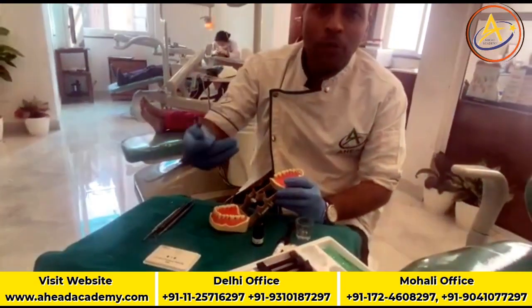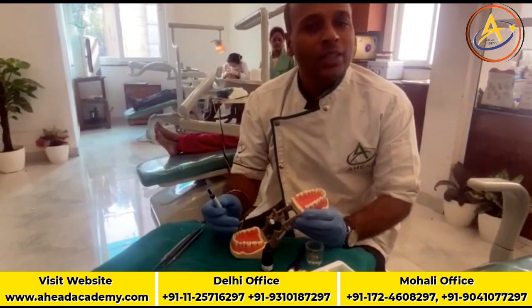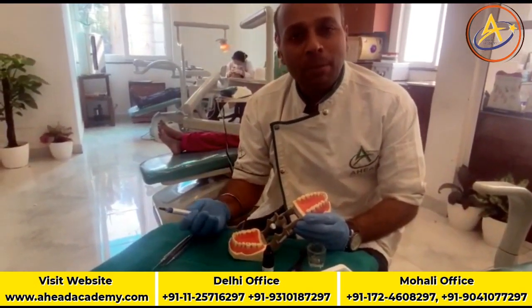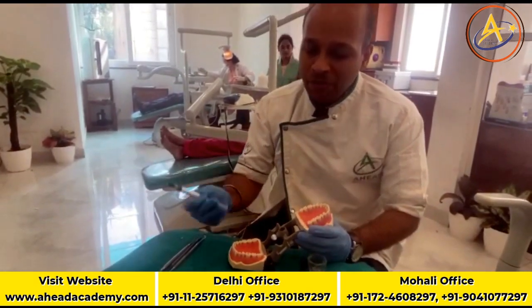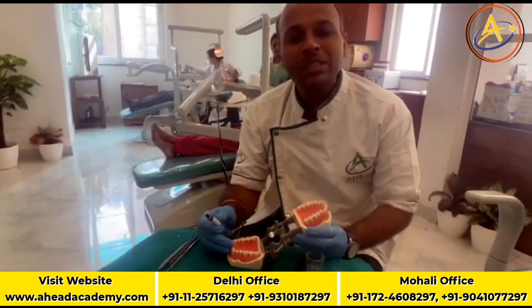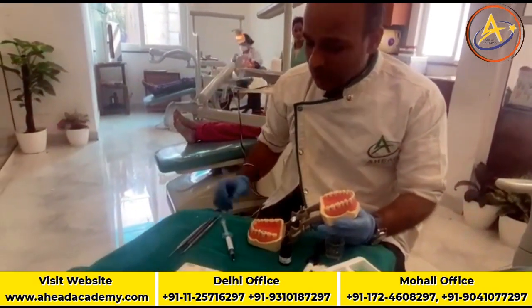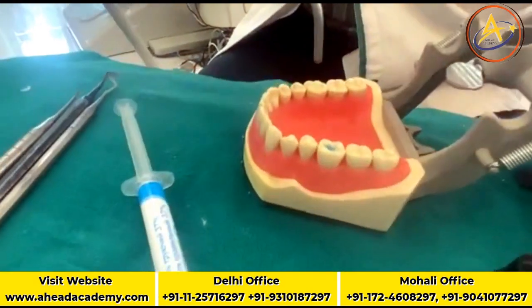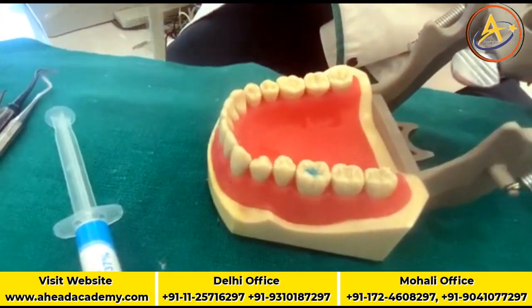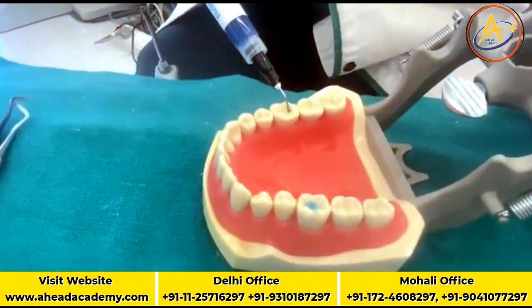Now, how do we perform this? After cavity preparation, we do the isolation of the tooth. If you can apply the rubber dam, that would be the ideal thing. However, if you are not applying the rubber dam, at least please apply the cotton wool and do apply the suction. And then we dry the tooth surface after cavity preparation. After drying of the tooth surface, then we apply the etchant.